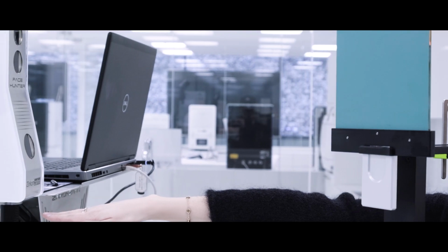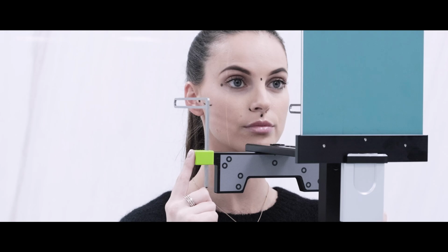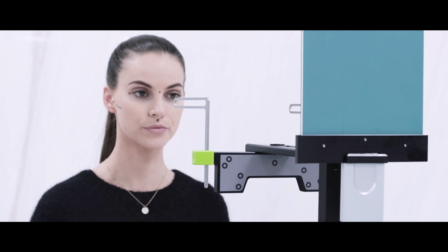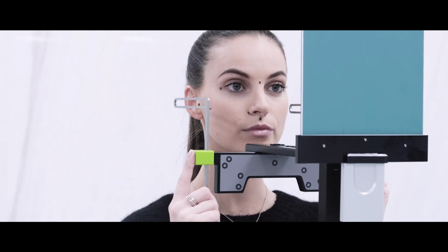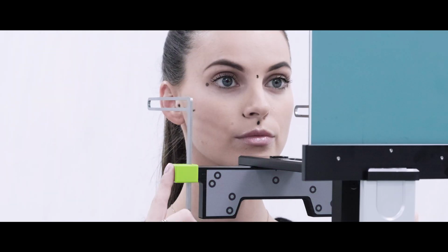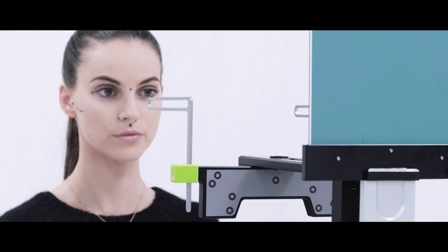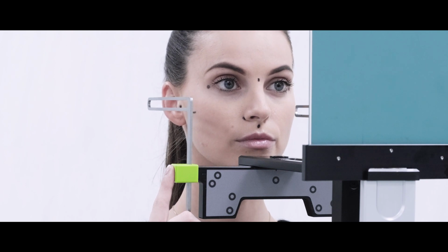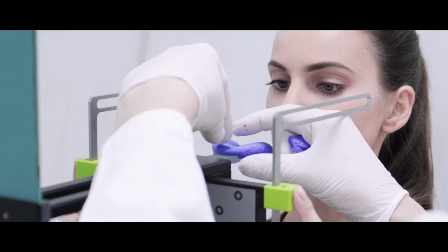The patient positions herself at a distance of about 70 centimeters from the Face Hunter and looks into her eyes in the mirror. In this way, she will spontaneously adopt her natural position. At this point, the dentist proceeds with the scans. Between the scans, the patient moves away from the PLANEFINDER and gets back in front of it. This operation is repeated a minimum of 3 times. It is very important that the patient puts her fingers on the side buttons of the PLANEFINDER in order to find balance easily and avoid movements that could compromise the scan results.